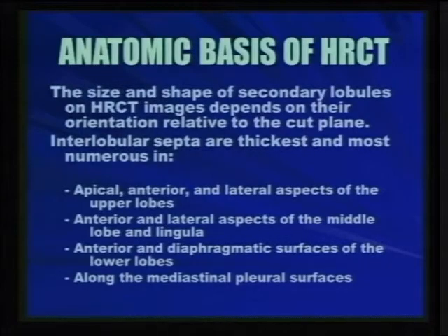But just remember that the secondary pulmonary lobules are better recognized in a healthy normal lung, more toward the periphery, where they're well arranged. But as you go toward the center of the lung, you have a lot of communication and a lot of disruption in the boundaries of the secondary pulmonary lobule. That way you don't recognize it as well.